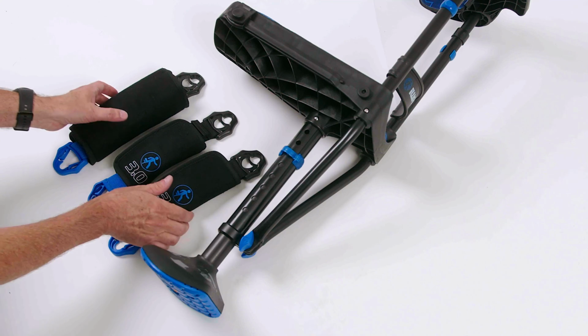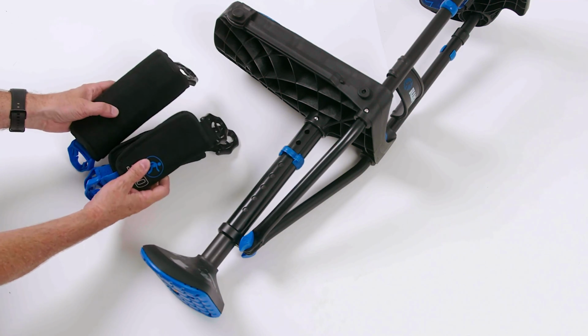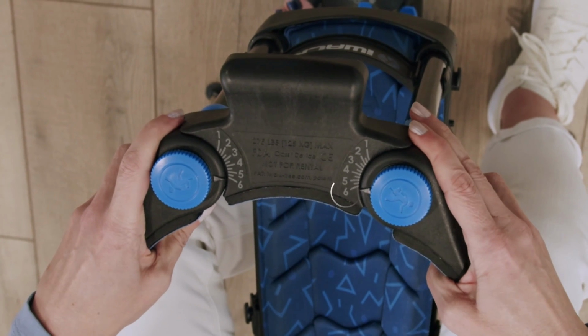Before we get started, the iWALK should be fully assembled per our video instructions. Confirm that the straps are removed and that the thigh supports are in the number 6 position.